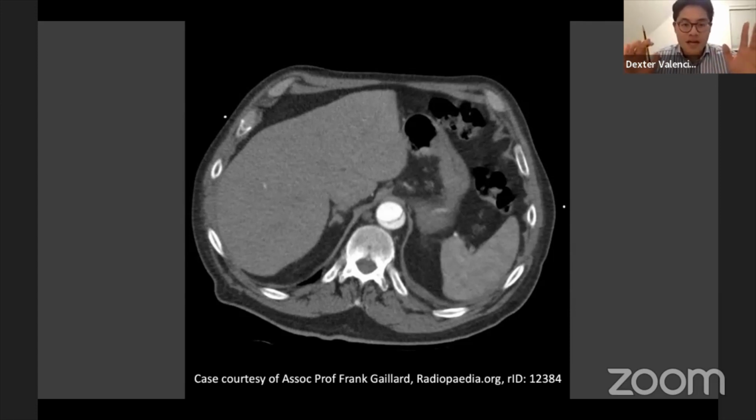So in some cases, I have seen subsegmental PEs not being treated by clinicians because they don't feel the risk benefit of anticoagulating the patient is there. So yes, there are subsegmental PEs which are not treated, but that's a decision made by the clinicians and the surgeons and the doctors, not by the radiologists. So we will report it. Are they less significant? That's for the doctor to decide. They probably aren't as significant as, say, a large PE, saddle embolus with right heart strain, if that answers your question.